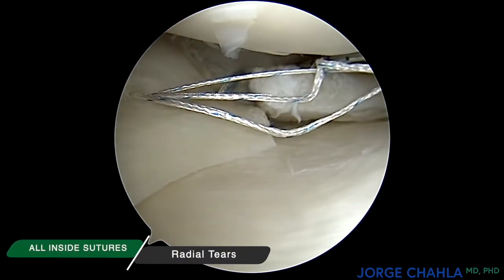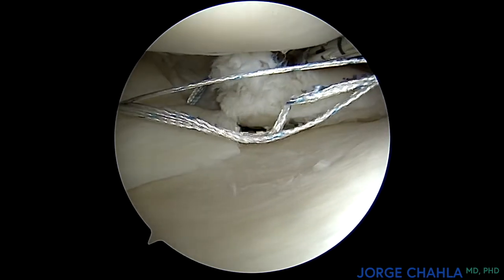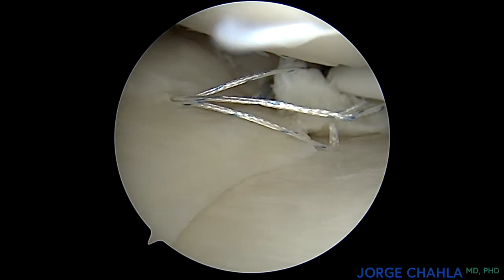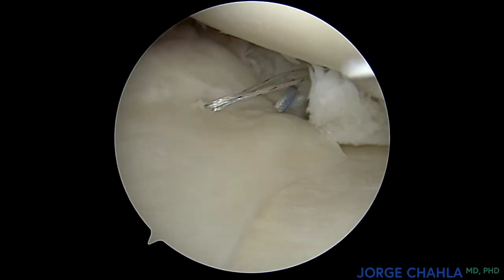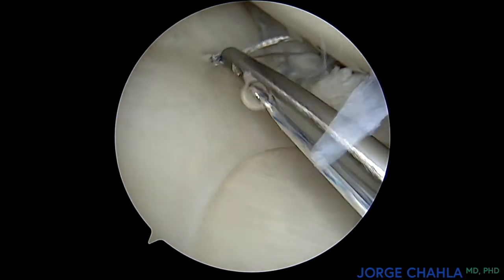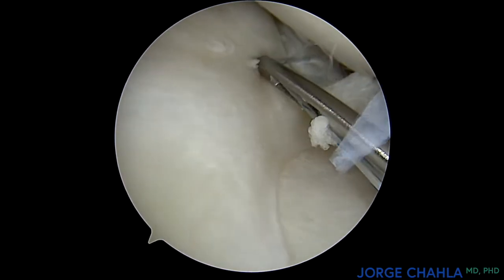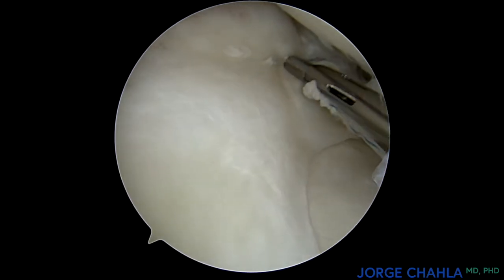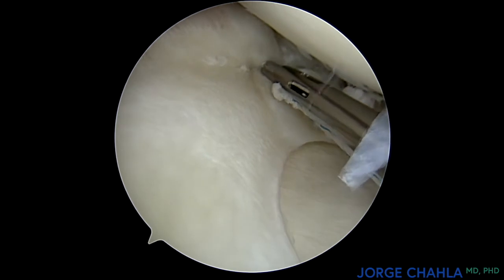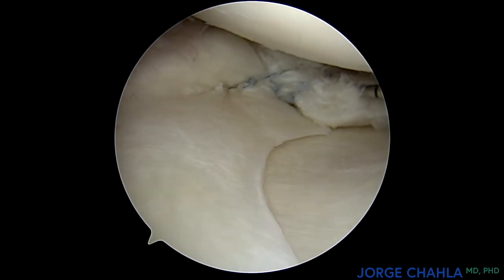Next, all-inside horizontal mattress sutures are placed to assist with reduction and fixation. The initial suture is placed centrally in the meniscus at a distance of approximately 5 millimeters from the tear in both the anterior and posterior directions. Appropriate tension is confirmed under direct visualization utilizing a tensioning device. The suture is then cut flush with the meniscal surface.